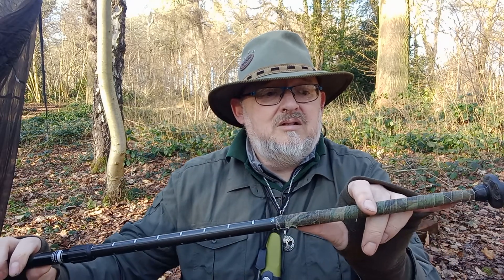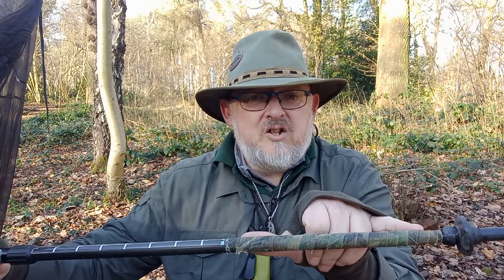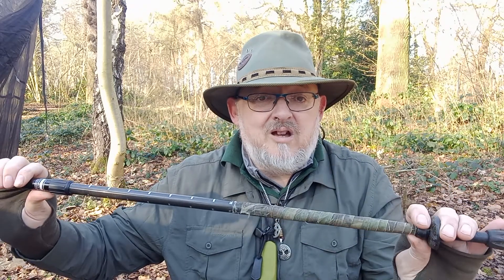I do check every now and again to make sure they haven't slipped. On the bottom nine or ten inches I've put some sniper tape wrapped around just to protect the lower part. When I'm in the woods going through undergrowth and brambles and creepers on the ground, it would scratch the hell out of it otherwise. This is actually the original piece of sniper tape from nine years ago and it's holding its own.